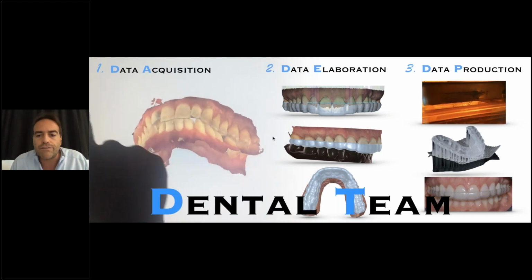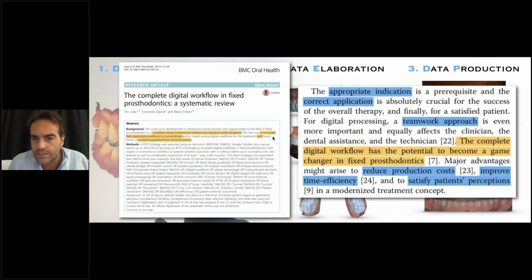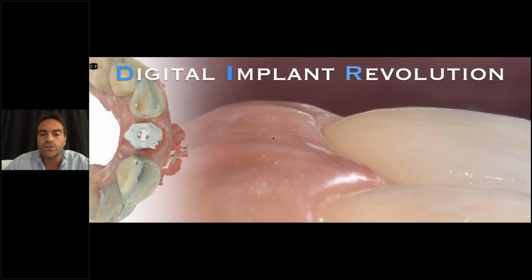And so, of course, if we have the big picture in front of us, if we have the appropriate indication, the correct application, and of course, as I wrote before, a teamwork approach, digital workflow, especially in fixed implant prosthetic, in fixed prosthodontic and in implant dentistry, is going to be the game changer of our daily clinical routine, because it will reduce the production cost, it will increase the time efficiency, and without forgetting that it satisfies incredibly the patient's perception.